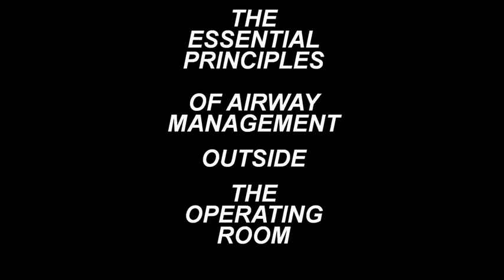The essential principles of airway management outside the operating room. This is essentially about the practical conduct of manual ventilation in an emergency situation anywhere in the hospital outside of the operating room. Upon arrival, first, confirm that the patient is unresponsive.